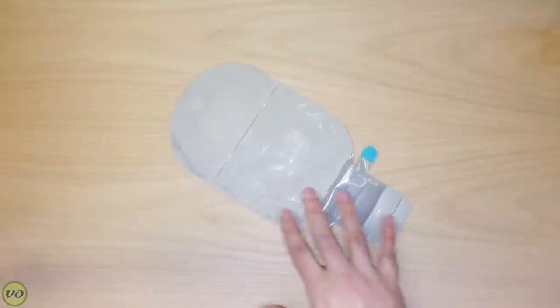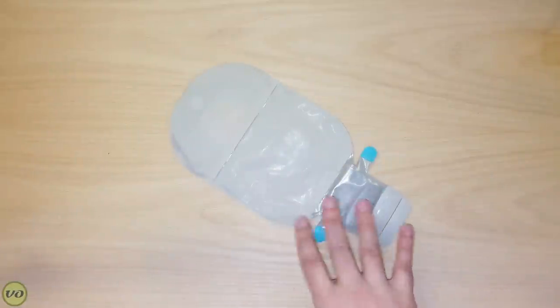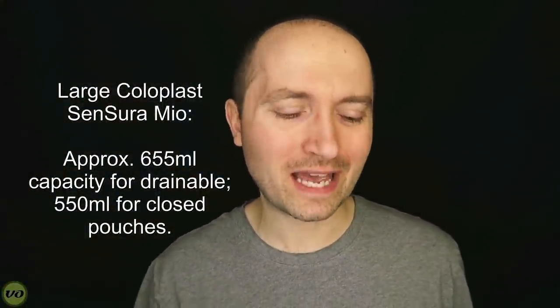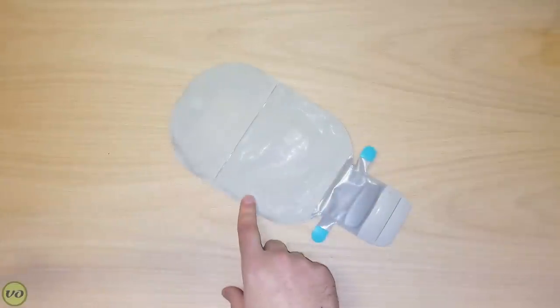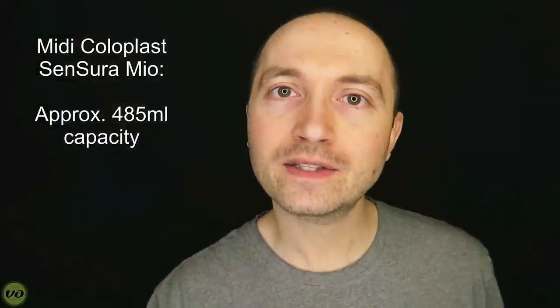I'm going to start off by first showing you the Coloplast Sensura Mio. This is their large size bag, which holds approximately 655 milliliters of liquid — that's like top to bottom. You're not going to really get your pouch that full, but that is the stated capacity. Coloplast does have a size smaller than that called their midi, which is their medium size, with approximately 485 milliliter capacity. For some people that have very little output throughout the day, perhaps they have a colostomy, midi bags are really great because they're nice and compact and easier to manage under your clothing.